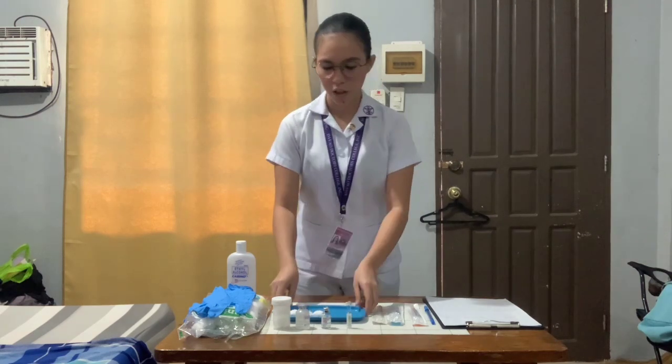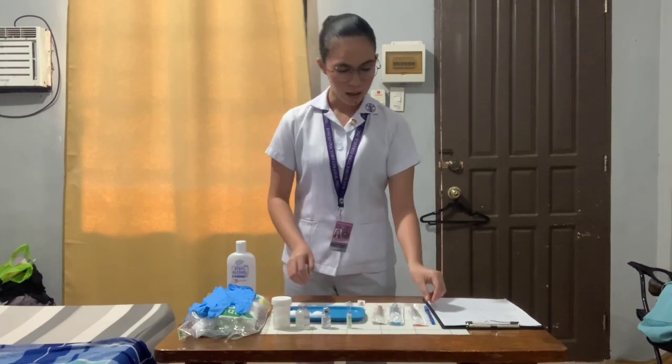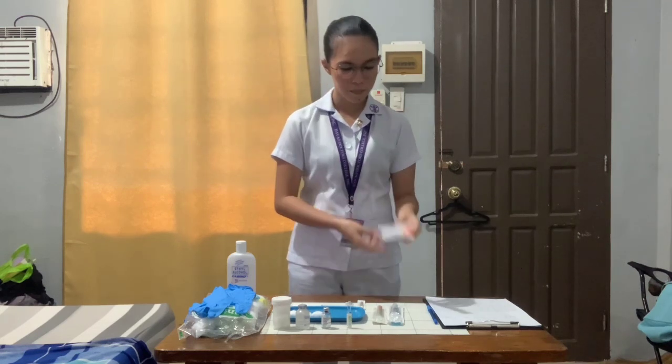I also have here my hypodermic tray. And I have here my blue ball pen, which I will be using later on to circle the site or the area of the intradermal skin testing. I also have here my tuberculin syringe, which I will be using for the intradermal or skin testing.